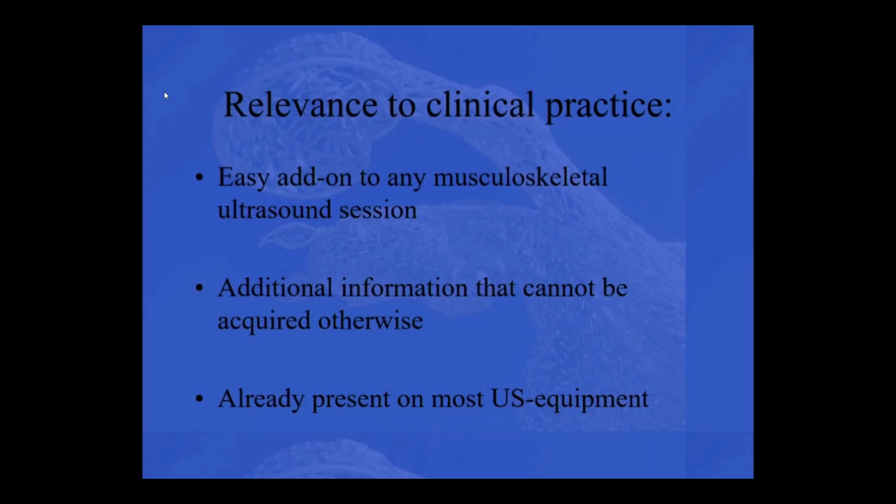It's easily additional information that you cannot really get quickly otherwise, and it's really easy to do. And what's good for us here today, and maybe not so much for all the exhibitors outside, is that quite often the option is already on your ultrasound machine, so you don't have to run out and buy a new machine. It's there.